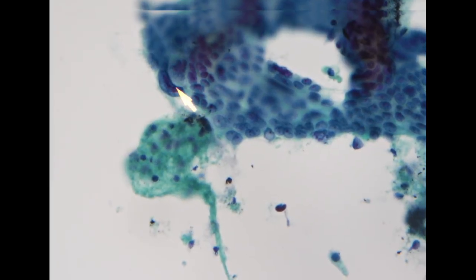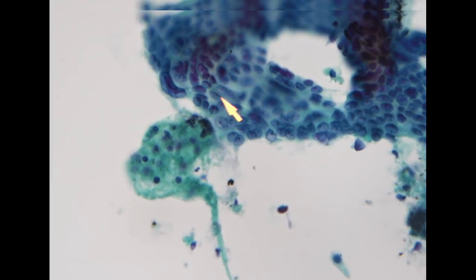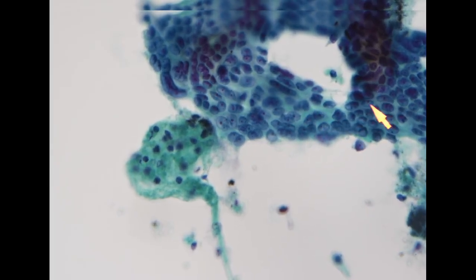So most of the cells in this specimen look malignant. Again, very interesting looking cells and much smaller cells, and the distance between each nucleus is uneven. Some with a big gap, some overlapping. So we definitely see disorganization.